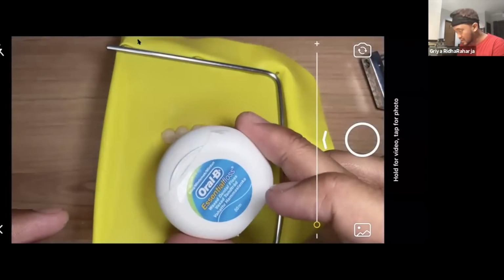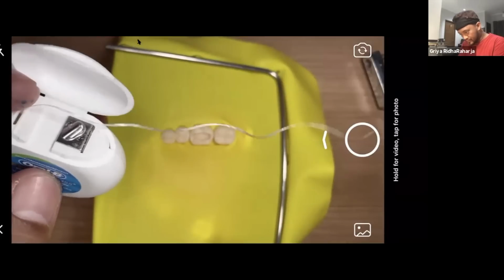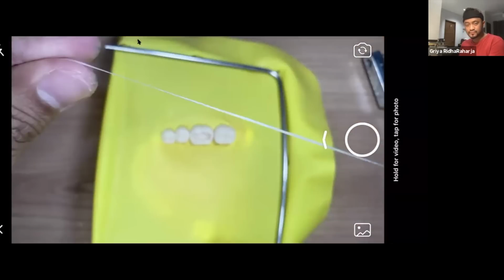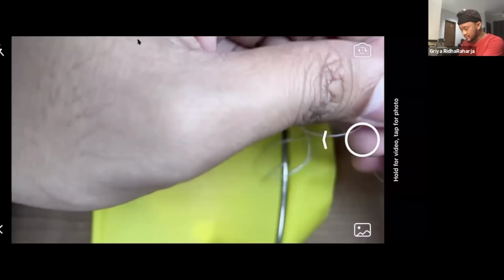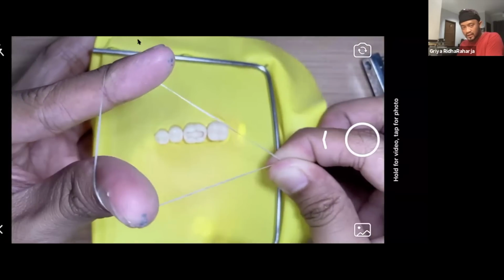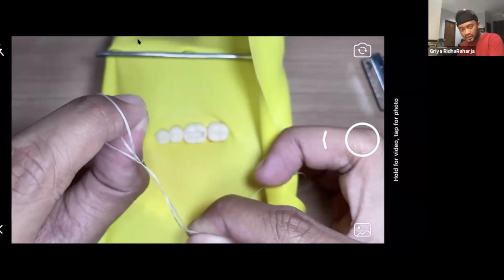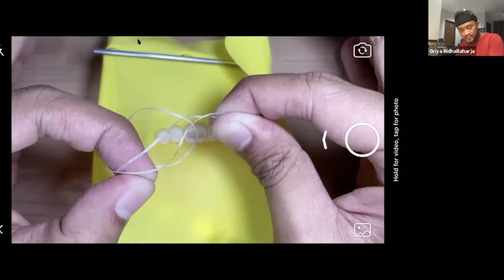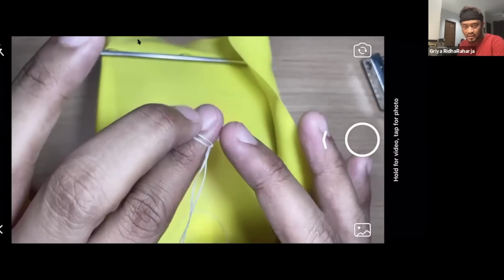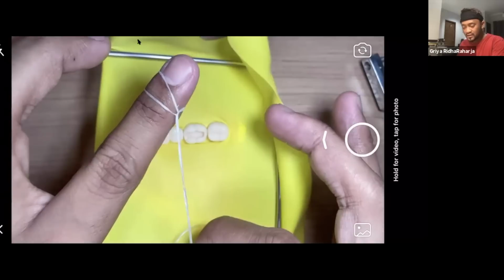For example, because I don't have a clamp today, I will show you how I create the double knot. Okay, just take the floss, maybe around, sorry, 30 centimeters. So this is your finger like this, make a triangle like this. Okay, triangle, and then flip back like this. Okay, and then make it together. Okay, and then release into the index finger. See, so they have one knot, which is not a good situation because this is not stable. Sometimes it's not so tight. Okay, so we need to double it.